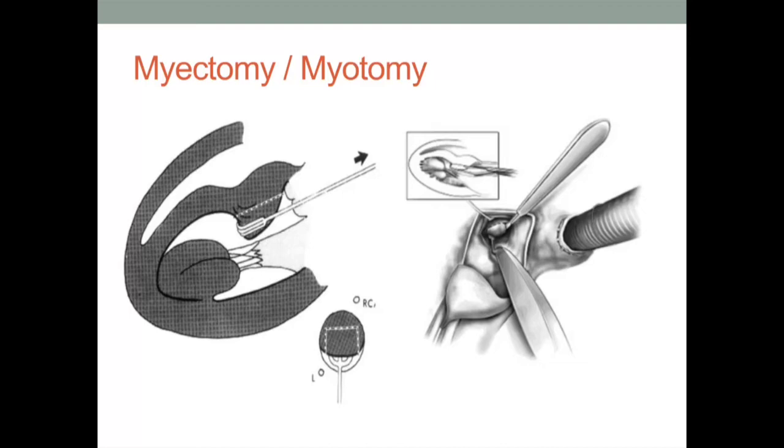A second longitudinal incision, parallel to the first incision, is made to be carried up within 8 to 10 millimeters of the aortic annulus at the commissure between the right and left coronary cusps. The area to the left of this incision is the left ventricular free wall. These two incisions are now joined superiorly, and a hook may be employed to allow for better traction of the proposed resected muscle, which can be easily elevated.